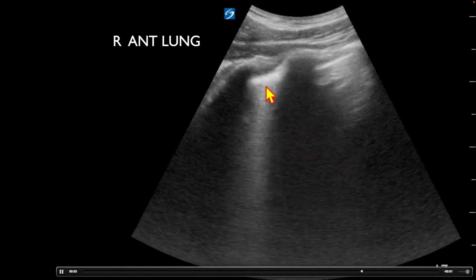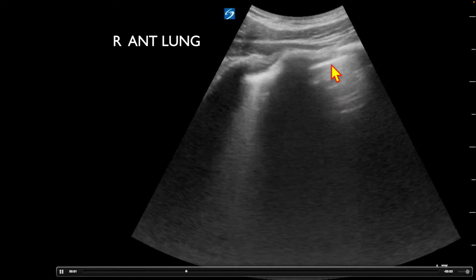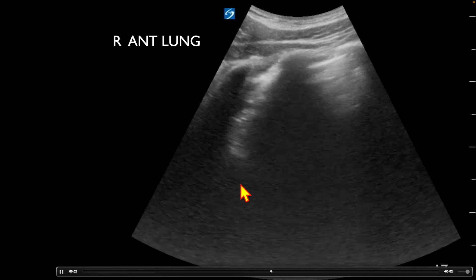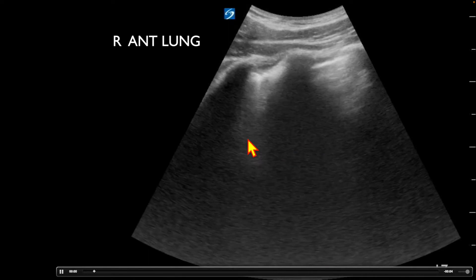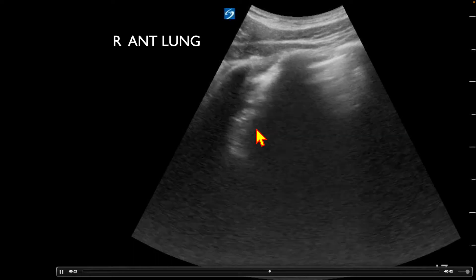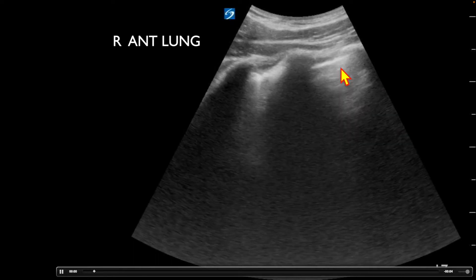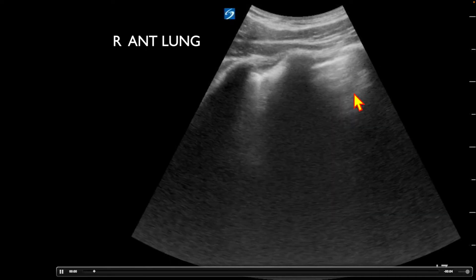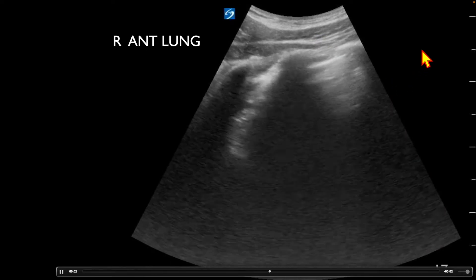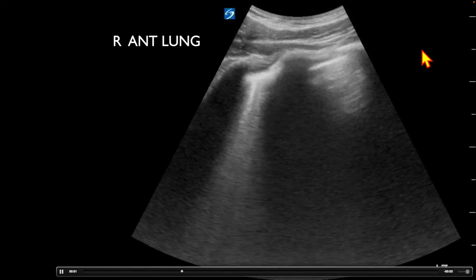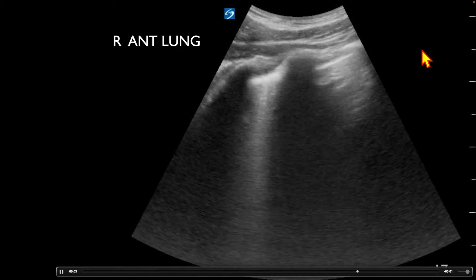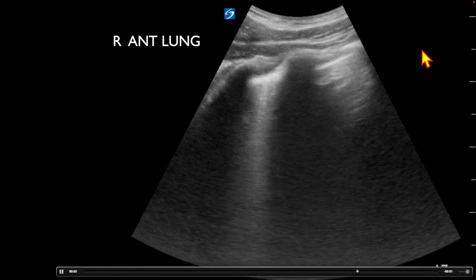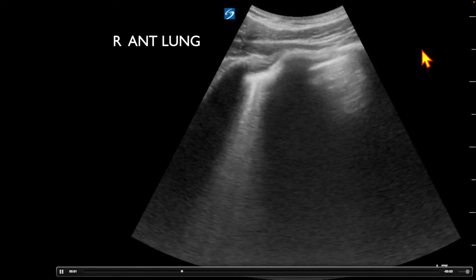We can clearly see there's lung sliding, as we actually see a B line come in here. This area with the B line can signify a pulmonary contusion in trauma. We can clearly see lung sliding here; it can be a little more difficult in this area and I'm not quite sure if, based off of this image, they felt there wasn't lung sliding present. Keep in mind that the absence of lung sliding does not rule in a pneumothorax — only the presence of lung sliding rules out a pneumothorax.